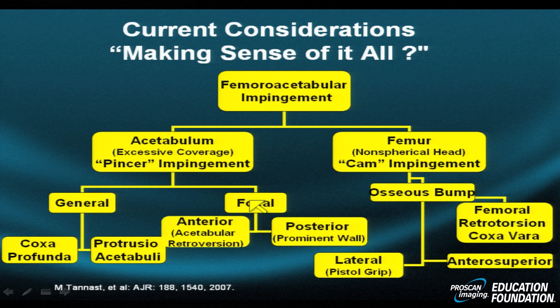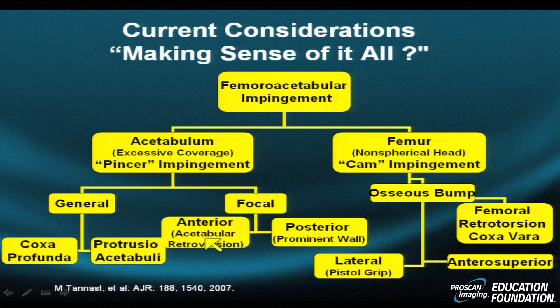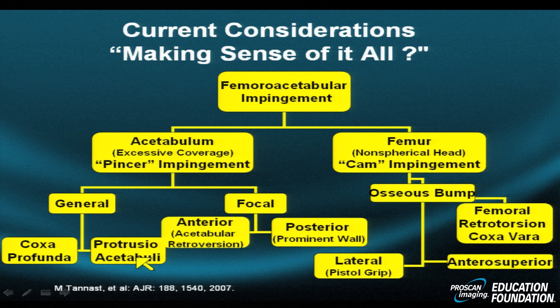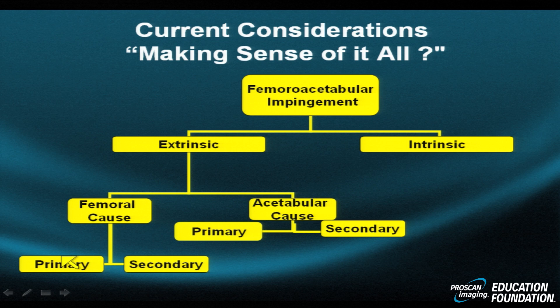In pincer type impingement, it can be generalized or focal. If focal, one wall may be overdeveloped — for instance, if it's the anterior wall of the acetabulum, the femoral head is pushed backwards, a condition called acetabular retroversion. If the posterior wall is too prominent or too deep, it may rotate the head forward, known as anteversion. In general forms of pincer type impingement, one may see a cup that's too deep — protrusio acetabuli with over-coverage, or coxa profunda.